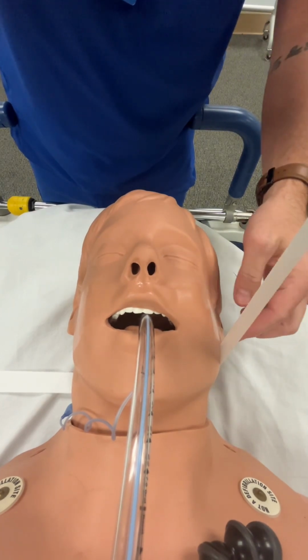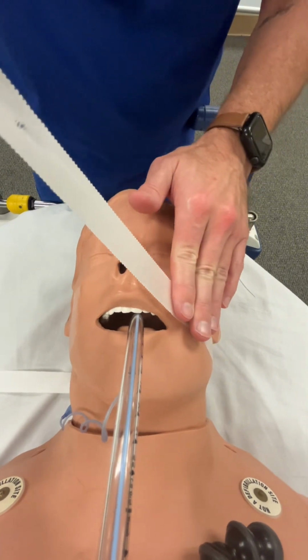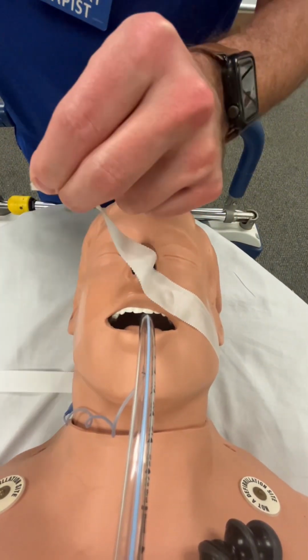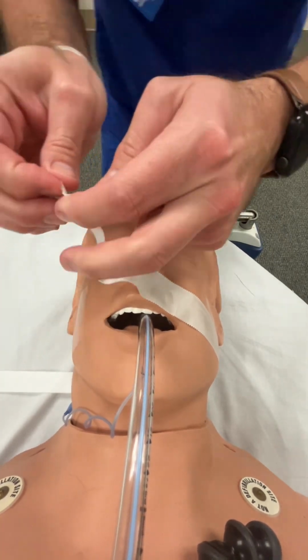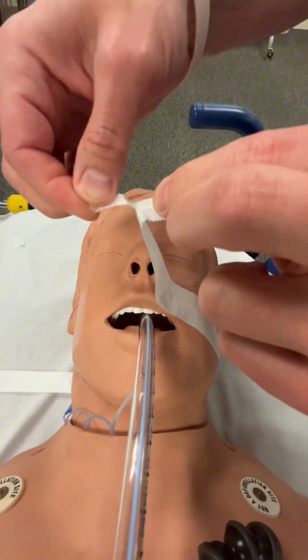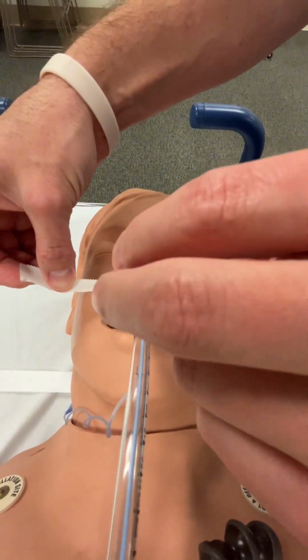Now you can just start bringing your tape around towards the tube. Make sure you're pressing lightly on the skin so that way it's sticking as you go towards your tube. Tear off any extra tape that you don't need. And now you want to start splitting the end. However, you want to make sure that you are not splitting it so far down. You only want it to go right to where your tube sits.